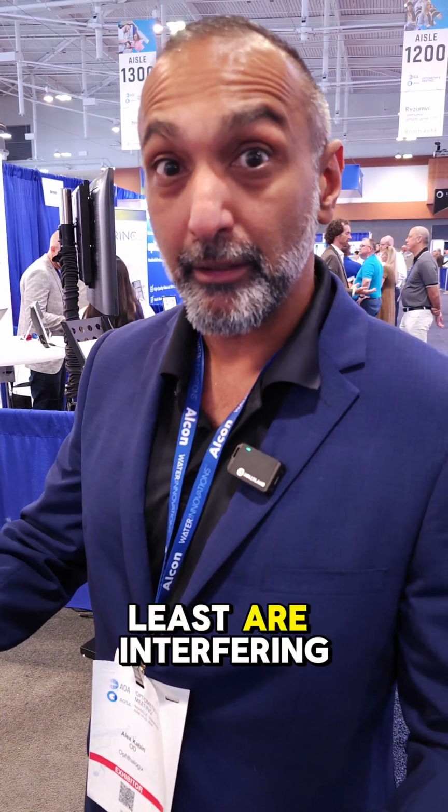Much of the time, these patients will have some sort of dry eye as well, but keep in mind, you're not necessarily treating dry eye. You're treating some form or forms of keratitis that have either contributed to the onset of dry eye, its propagation, and at the least are interfering with its improvement. So when you have patients for whom you've identified they have dry eye, you're treating them with seemingly appropriate dry eye treatments, but they're not getting better the same way other patients are.